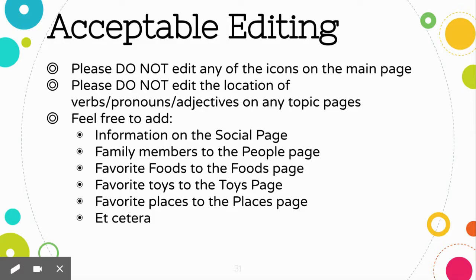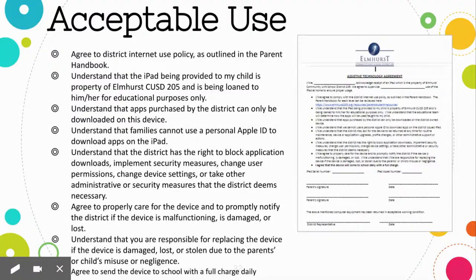If you don't feel comfortable editing on the device, but you have vocabulary you'd like to add, please feel free to send me or your child's teacher or speech therapist an email and we can work together to get it added for you. The last thing to review is the district's assistive technology agreement for use of the device at home.